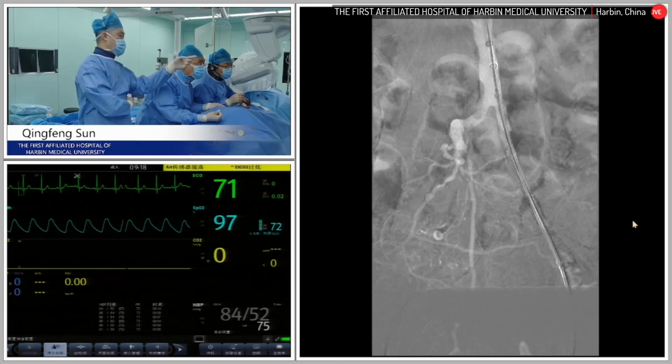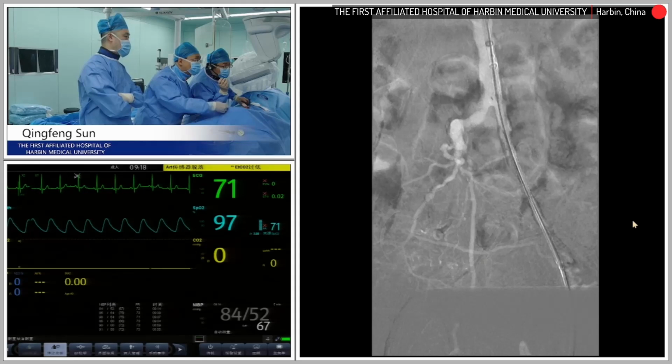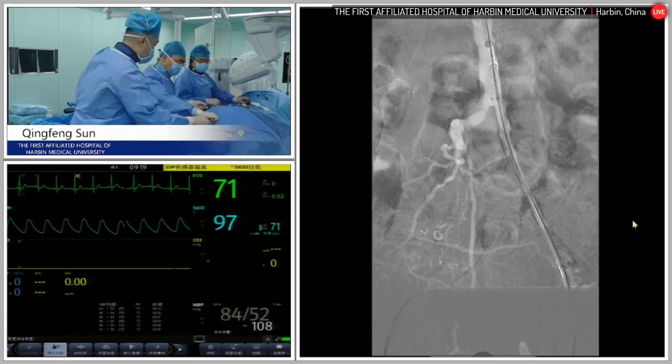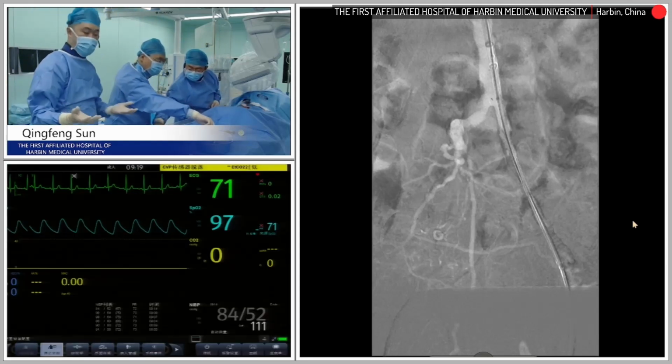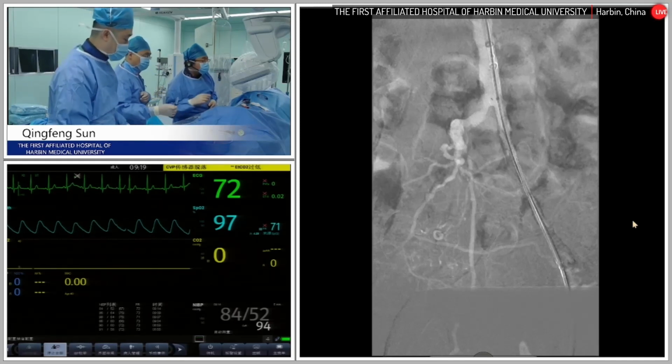So for the roadmap, you can see the original place for the proximal end, and right now, very nice. Perfect, perfect, wonderful. See, I told you guys, I learn every time. Tips and tricks every time.